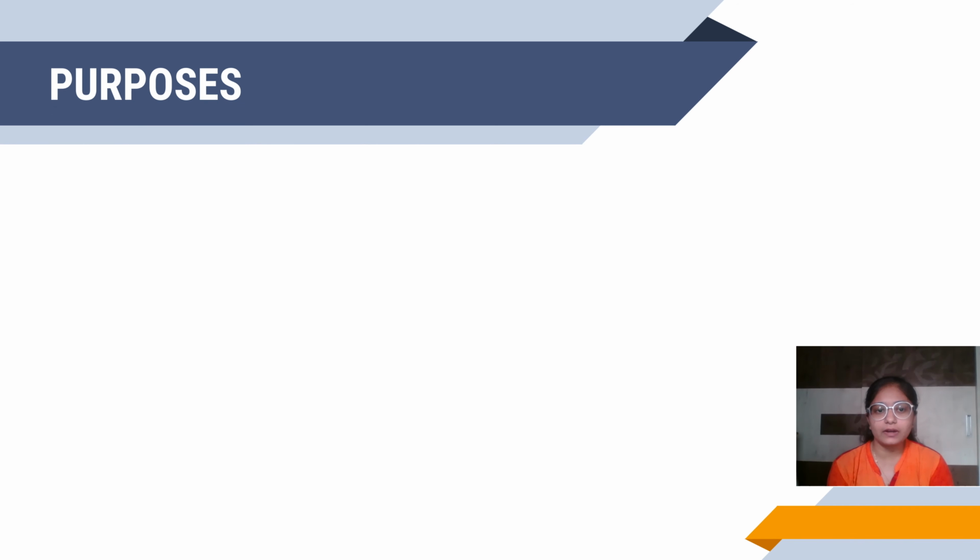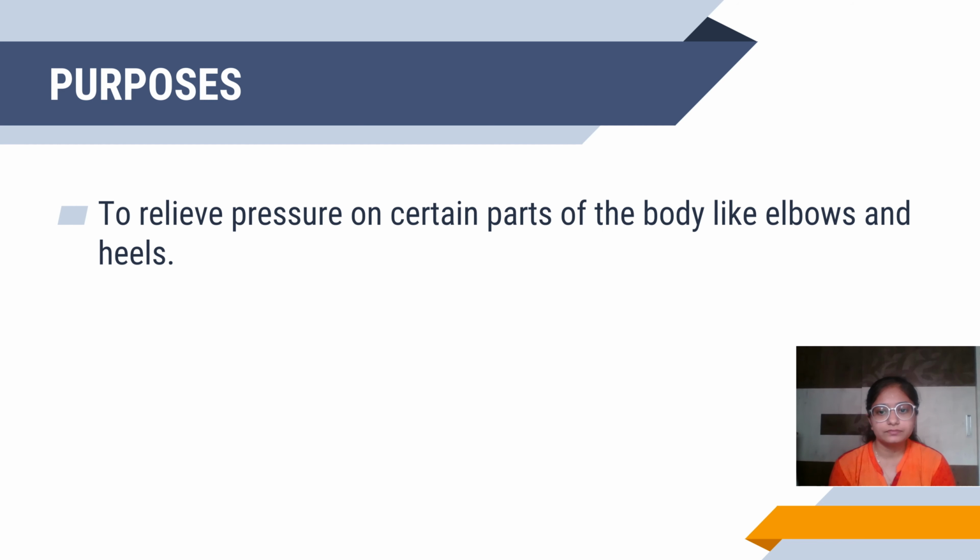The purpose of air cushions: for relieving pressure on certain parts of the body like the elbows and heels, and to provide comfort to the client.